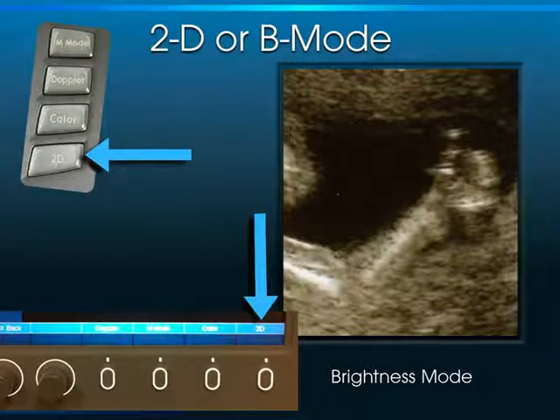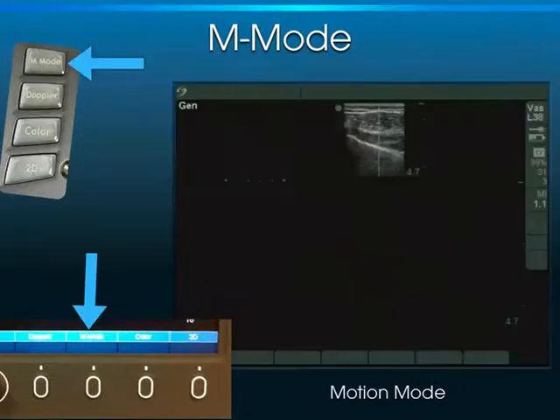Now remember that with the Sonosite S machine, we have the following. We've got the 2D button, and that's basically the brightness mode, and that kind of resets the whole ultrasound machine back to the white dots on a black background. On other products that Sonosite makes, the 2D button is in a slightly different location. This is on the machines we have in the ER, for example, the turbos. But either way, 2D means just reset the machine, brightness mode.